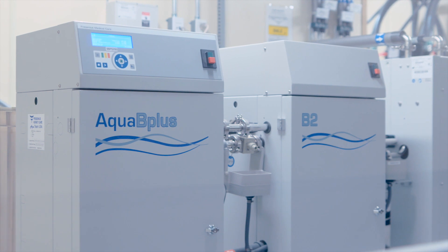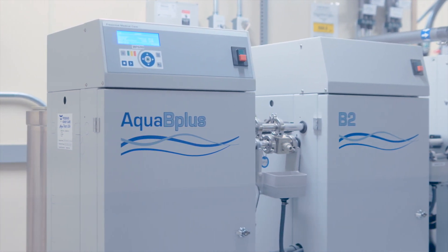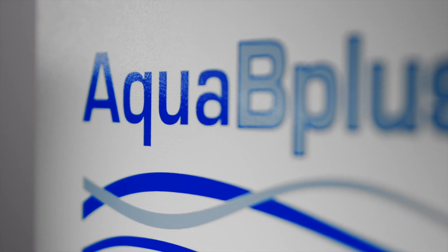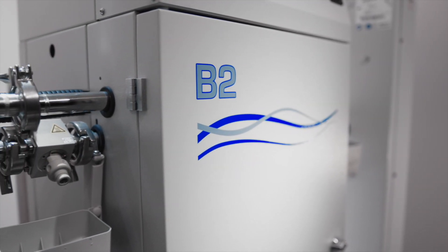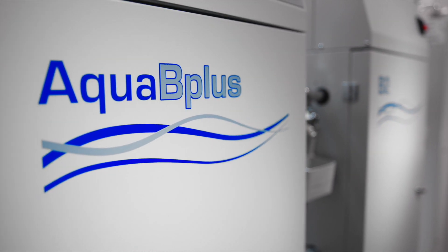Welcome. You're about to get an inside look at our fully installed dialysis water treatment system featuring the Aqua B Plus. The Aqua B Plus provides water of AAMI, ANSI, ISO standards quality for hemodialysis treatment with the versatility you need in a compact design.